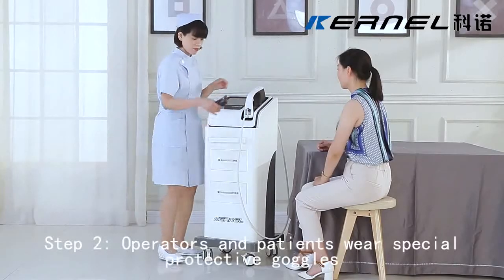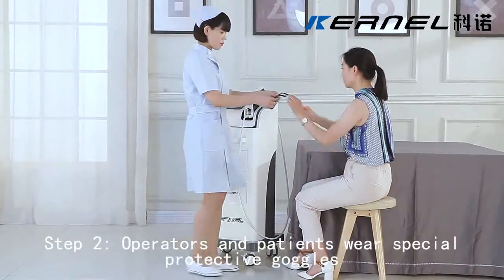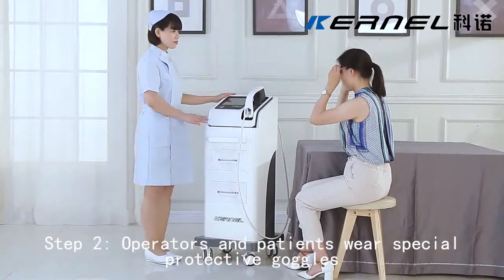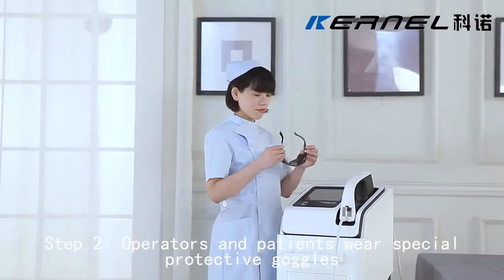Step 2: Operators and patients must wear special protective goggles.